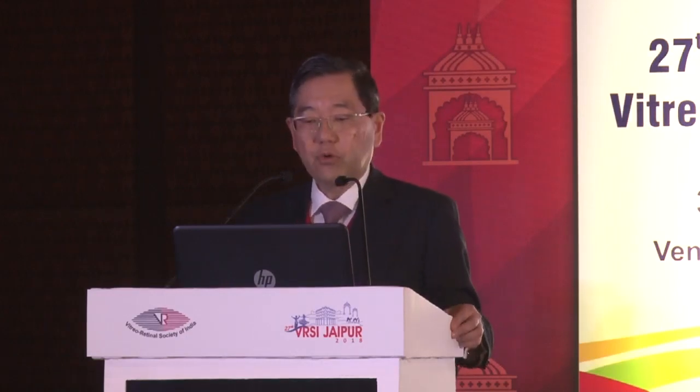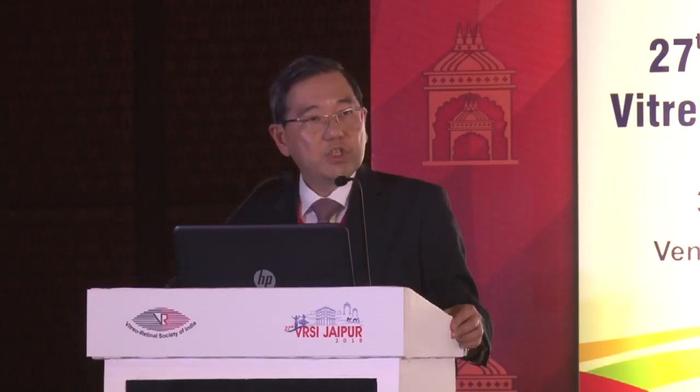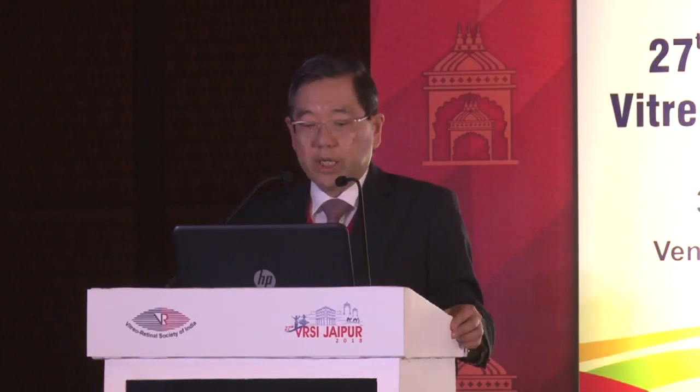This is an illustration of what an electronegative waveform looks like. You can see a normal A wave in case 4 and case 7. These are two of my cases. And a significant reduction in the B wave compared to the normal.